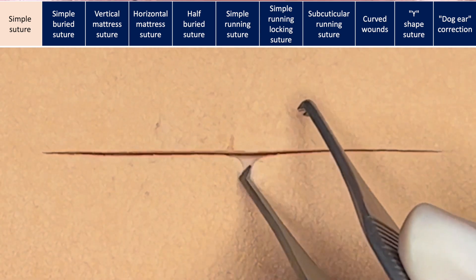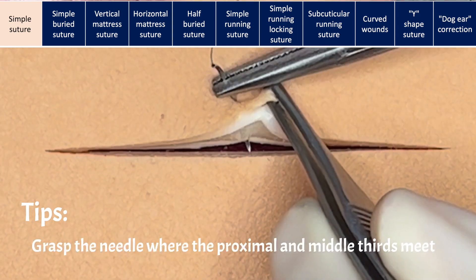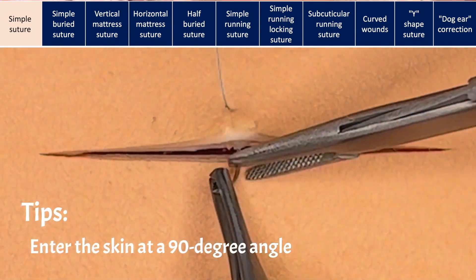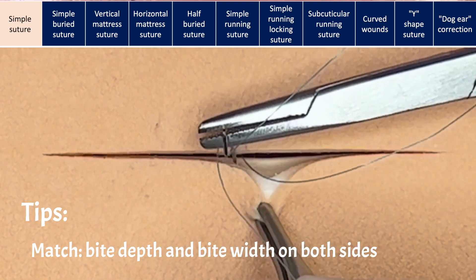Simple suture is the most common suture that you will be using in wound closure. Some tips: grasp the needle where the proximal and middle third meet. The needle should enter and exit the skin at a 90-degree angle. Match the bite depth and the bite width on both sides of the wound.